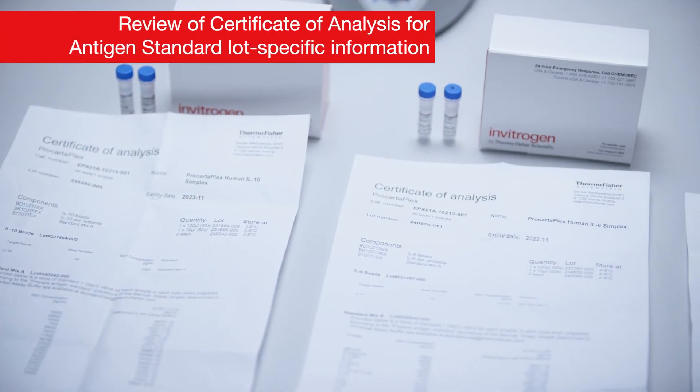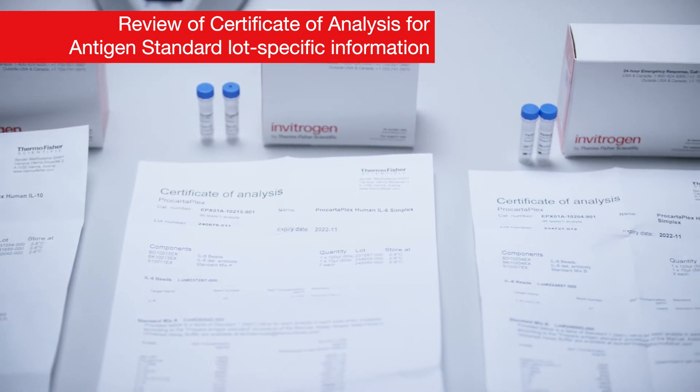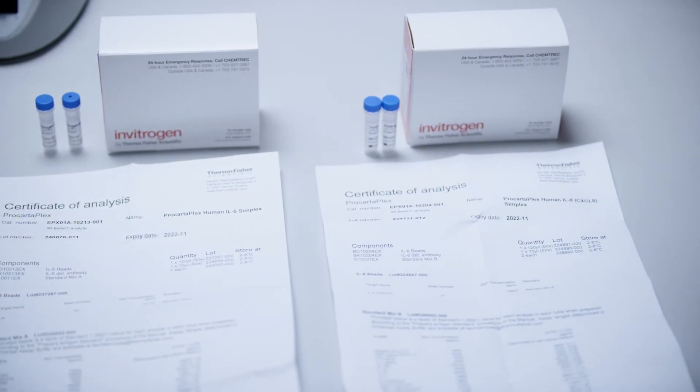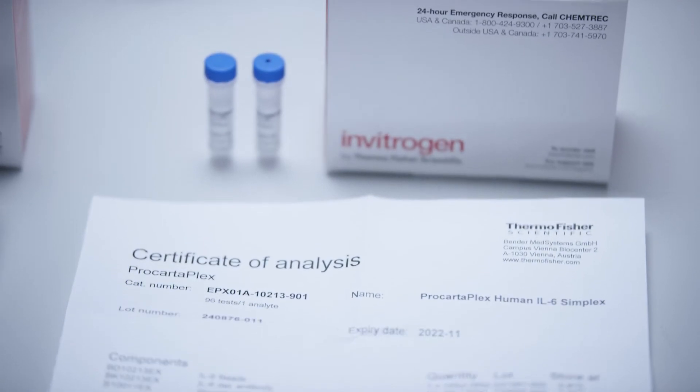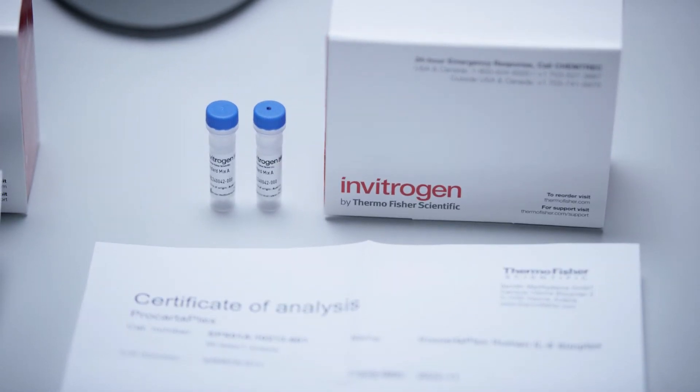Each ProCartaPlex simplex kit is shipped with two identical vials of each antigen standard to permit the user to run the assay twice, if running a partial plate. Carefully review the Certificate of Analysis for lot-specific information on the kit components and take the needed antigen standard. Only one vial of each antigen standard set is necessary to prepare the complete standard curve. Some simplex combinations contain several different sets of antigen standards that require pooling prior to use in the assay.